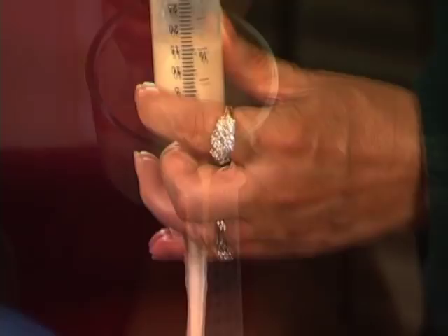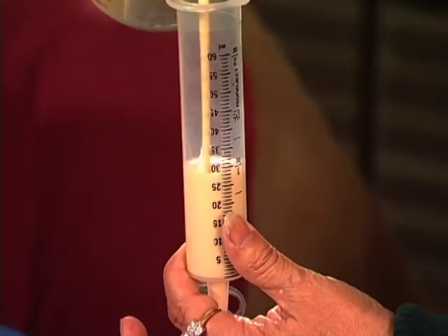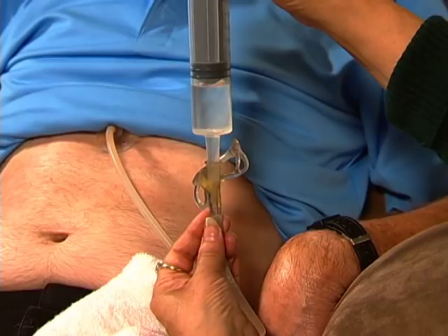Repeat until the prescribed amount has been given. Flush the feeding tube with at least 1 ounce of water, or the amount prescribed by your physician. Replace the cap on the feeding tube port.